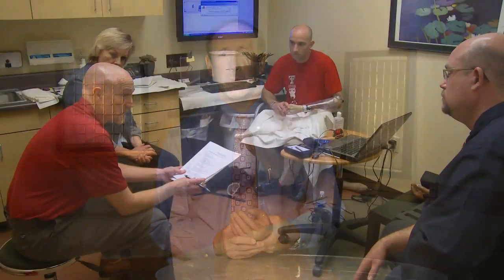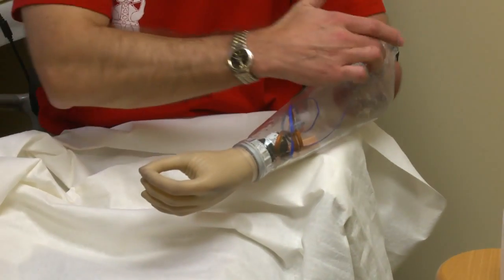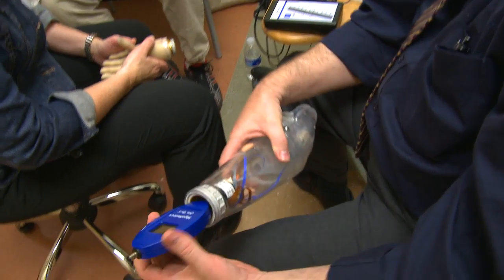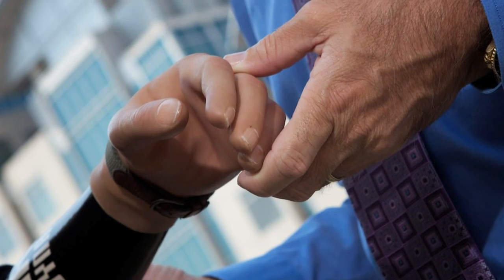At Advanced Arm Dynamics, one of our goals is to always provide the most up-to-date technology for our patients. Part of that commitment is really looking at electric hands, and over the last 20 years we've really been involved with development on hands. We work with manufacturers all over the world and create a partnering atmosphere where we're involved early on with the development of technology. This partnering allows us to bring this technology very early to our patients, and our patients play a critical role in the development so that the final product is as optimized as possible.